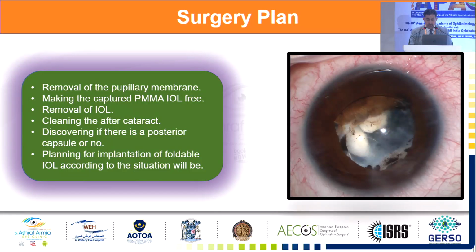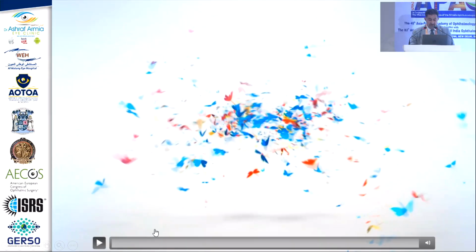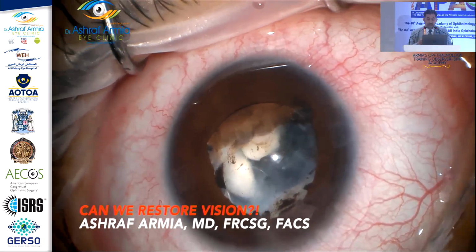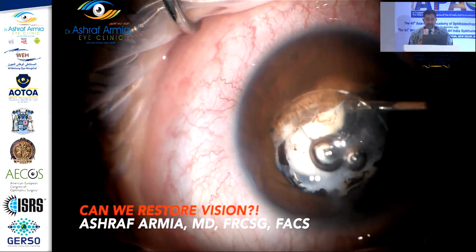Either you remove the pupillary membrane, making the captured PMMA IOL free, remove the IOL, clean the after-cataract, discover whether there is still a posterior capsule or not, and plan for implantation of a foldable IOL if the situation allows. So let's go for surgery and enjoy the journey, because it was not an easy case. I always think that what I feel inside the eye is different from the slit lamp. These are all my challenging cases like this.